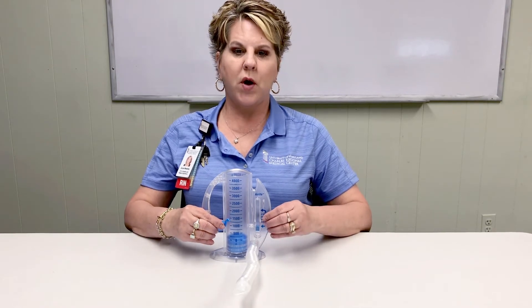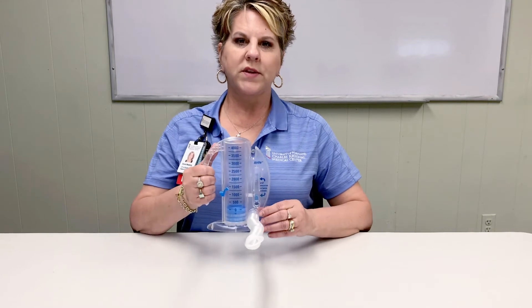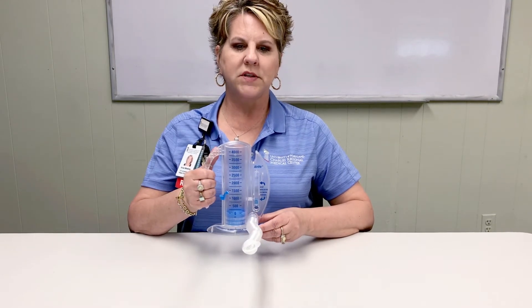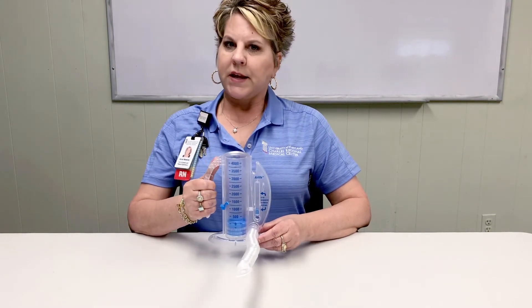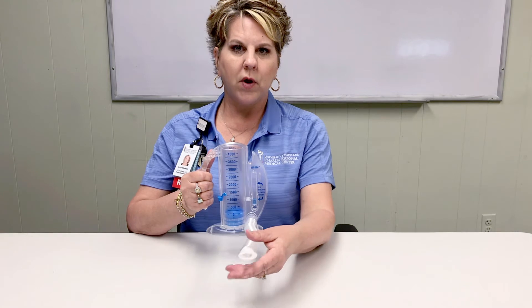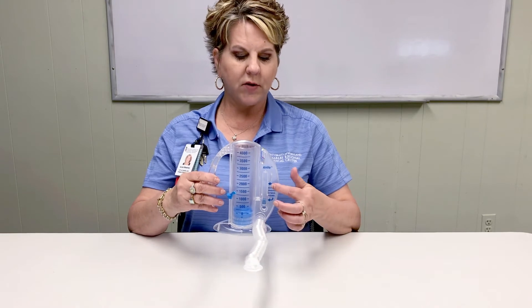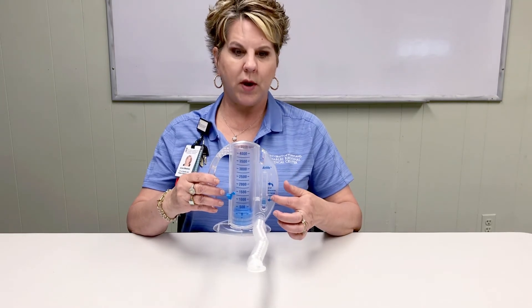To use the incentive spirometer, you will sit up straight. Hold the incentive spirometer in an upright position. Take a deep breath and exhale. Place the mouthpiece in your mouth, forming a tight seal with your lips around it. Slowly inhale, and as you inhale, the blue piston will rise to your goal marker. The flow indicator needs to stay between these two arrows.